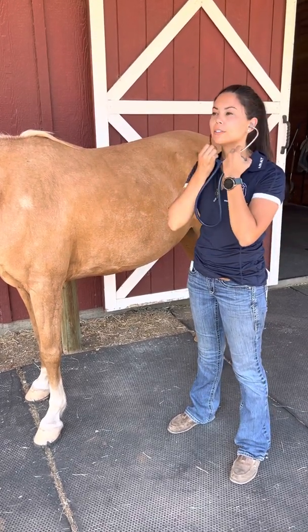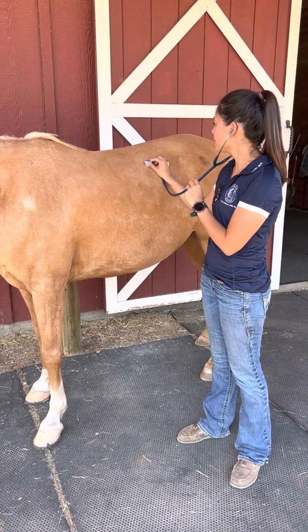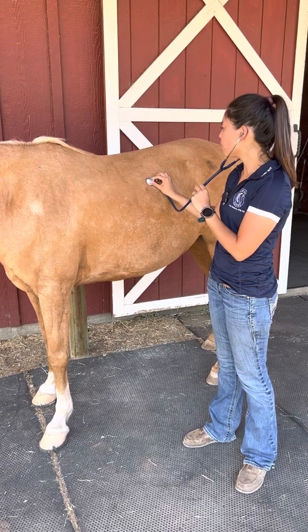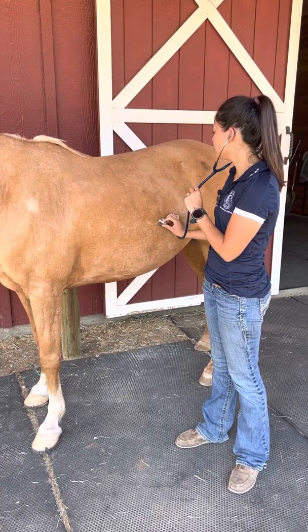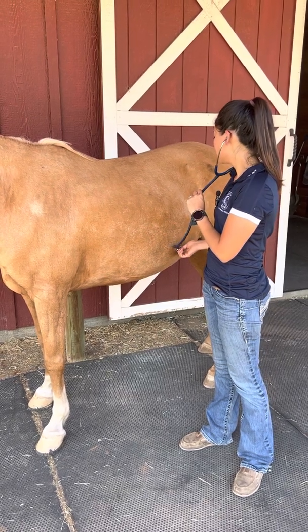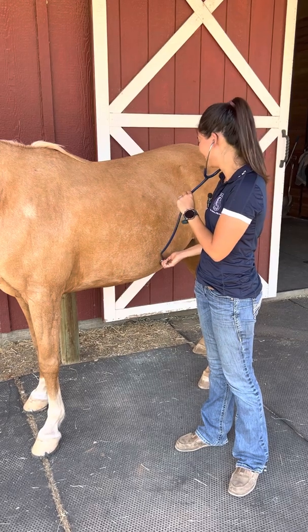So to listen for gut sounds, once again, put your stethoscope in, and you're just going to listen in these quadrants. If you don't hear anything for about 45 seconds, that's delayed gastrointestinal sounds. But usually, you can hear some pretty good gut sounds pretty early. I just got a really good one.